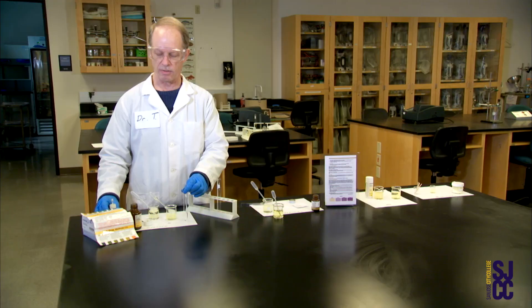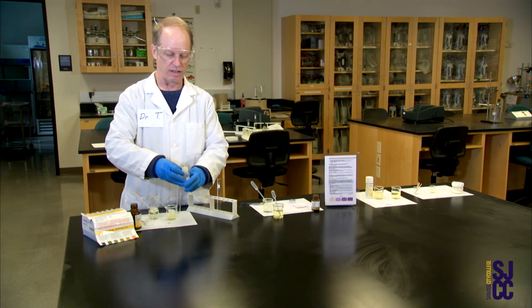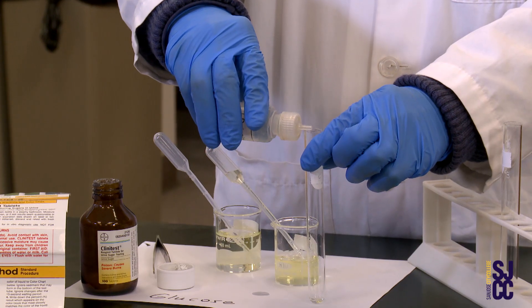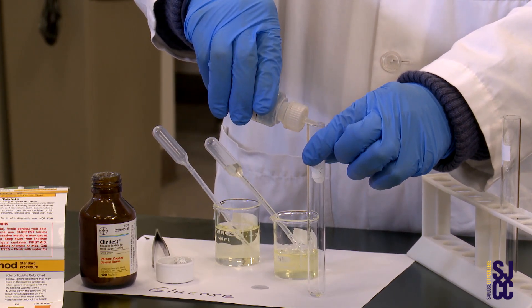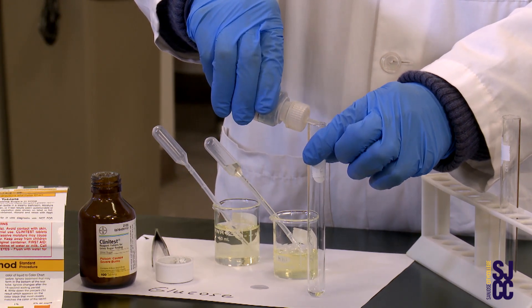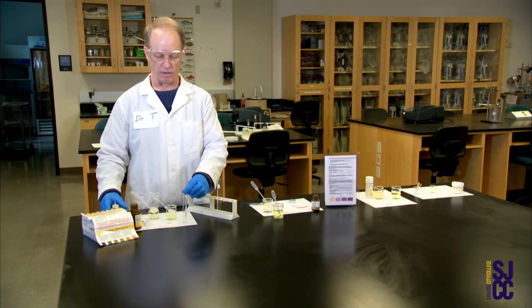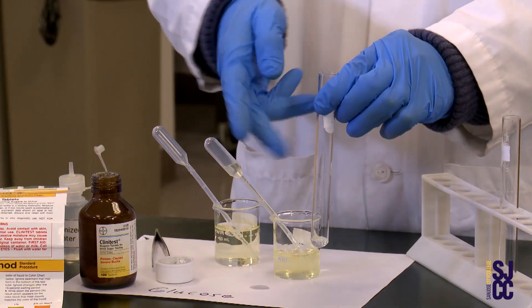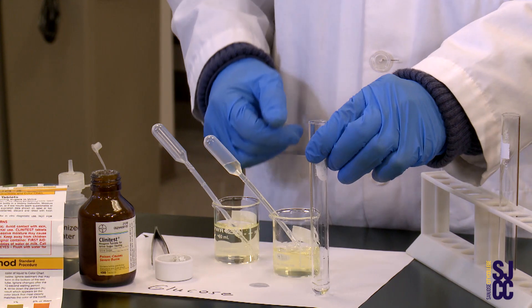I've got some deionized water — DI water, as we call it. I add ten drops of DI water: one, two, three, four, five, six, seven, eight, nine, ten. Done with the urine and water. I'm going to mix it just a little bit, the way we mix things, with our fingers gently like this.